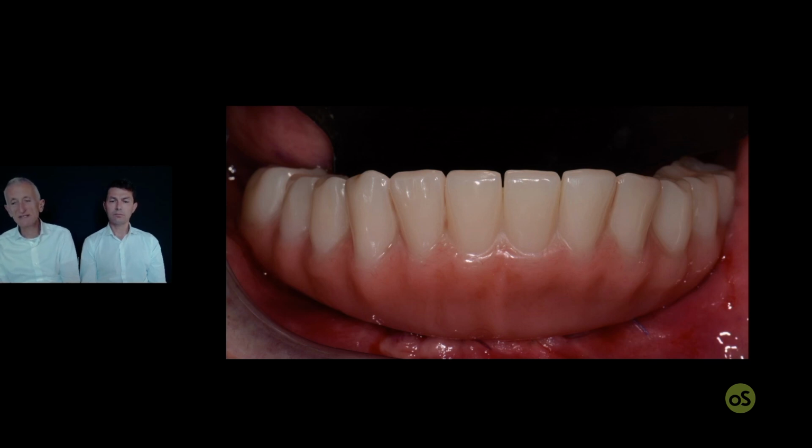So it is definitely a good idea, and for the Italian market, I think if they could benefit from some aesthetic improvement, probably they could spread much more. At this moment, I think they are probably not so commonly used. But my opinion is that they are potentially a great synergy.